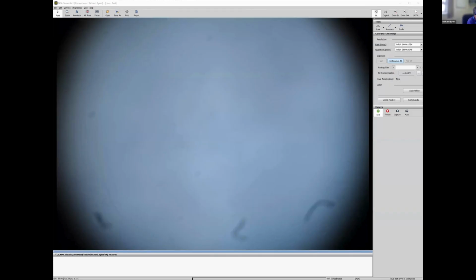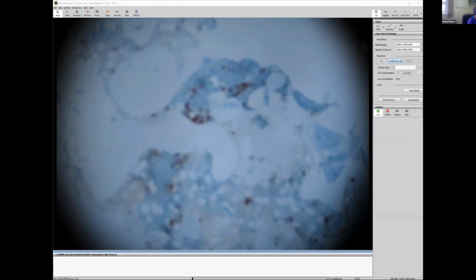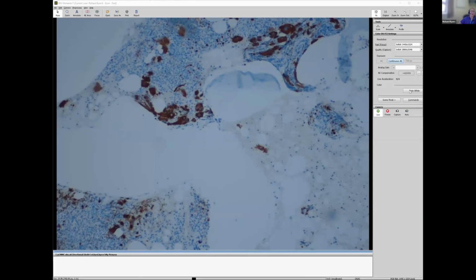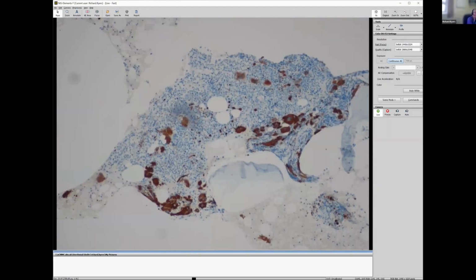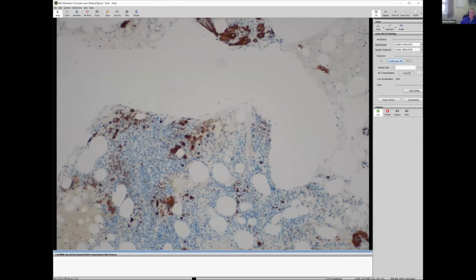Okay, I can show you the megakaryocytes. The CD61 stain, usually you can see them quite well in myelofibrosis. And here they are. So we've got large numbers of atypical clusters. Now, as I said, you could say, yeah, but the patient's been treated, it's post-chemotherapy, it's a regenerative marrow, and we know that you can get all kinds of slightly dysplastic looking features in a regenerating marrow. But I don't think that's the case here because these clusters are just too big and there are just too many of them. So I think this is residual myelofibrosis in this patient.